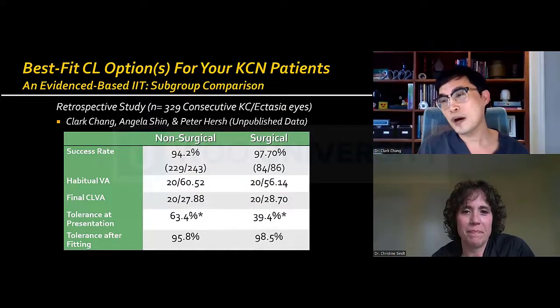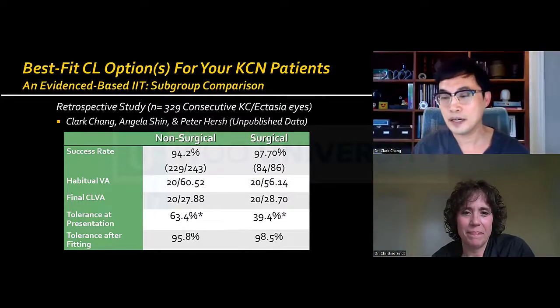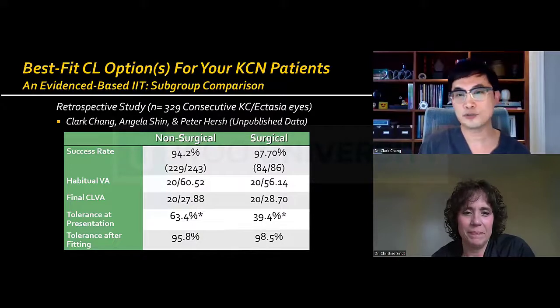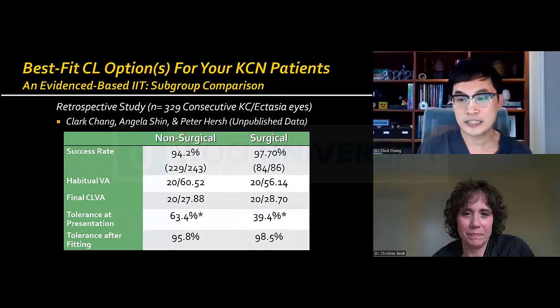And also there's possibly, I think, the perfect coupling type of concept, where, remember I mentioned that a lot of these patients in the 329 eyes that were retrospectively reviewed had actually had a surgical procedure or medical treatment procedure done.